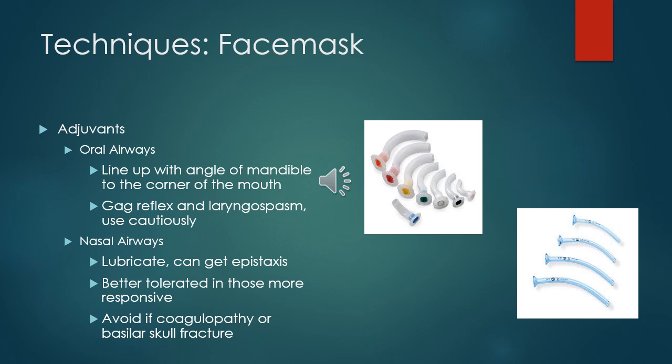A nasal airway is typically better tolerated by a patient who is semi-conscious. Be sure to lubricate it. It can cause epistaxis, so be careful. And then do not use this if there's concerns of coagulopathy or if there's any concerns of midface or basal skull fractures.